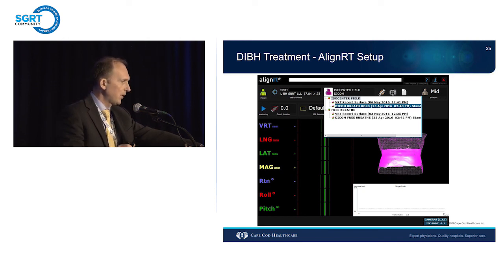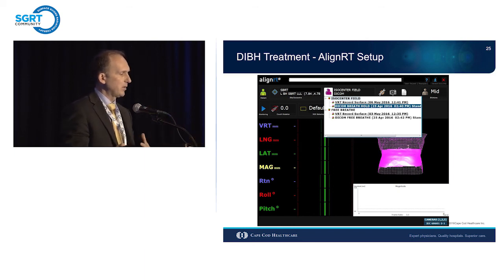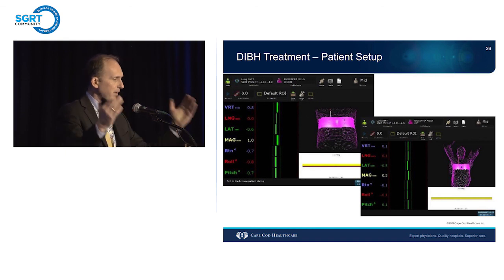One more thing here. This is not comparing the captured image, just the resolution, how it's different. If you look at the DICOM, how many data points are there and how the region of interest looks, and then look at these captured, a little bit less information, but it works a lot better when you are monitoring this surface than the DICOM surface, at least in my experience, especially when you're blocking the cameras.